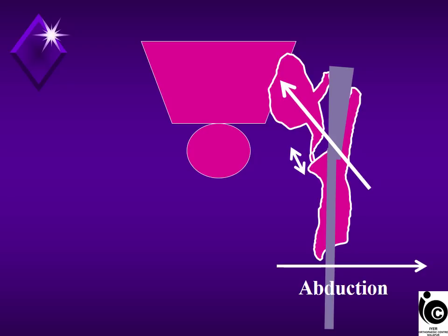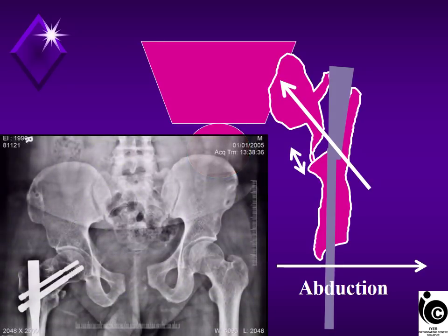This opening of the fracture medially as well as superiorly leads to a screw length longer than the 100 millimeter required, because the nail is acting as a spacer, and normally all these nails have a proximal end which is 16 or 17 millimeter. So the shaft has been lateralized by almost 2 centimeter because of this. This is what I had shown you earlier. This is what has happened probably. Since it is not my case, I can only say it's probably. Lateralization of the shaft.